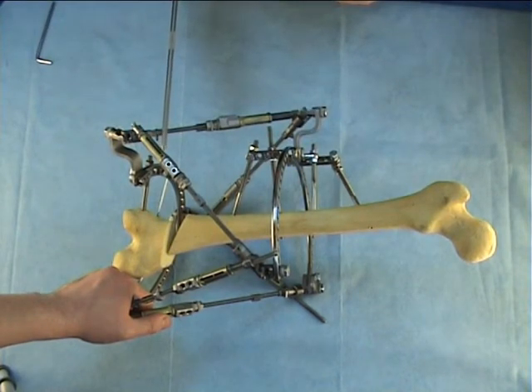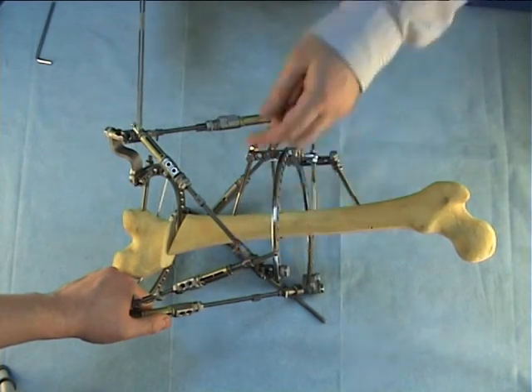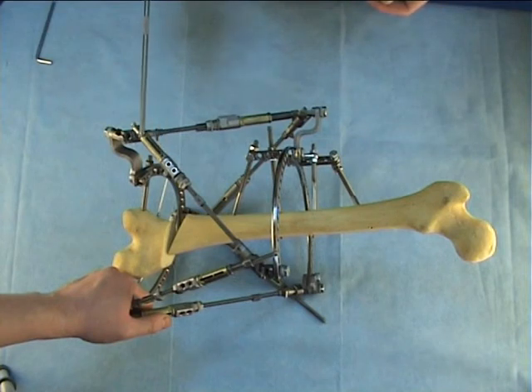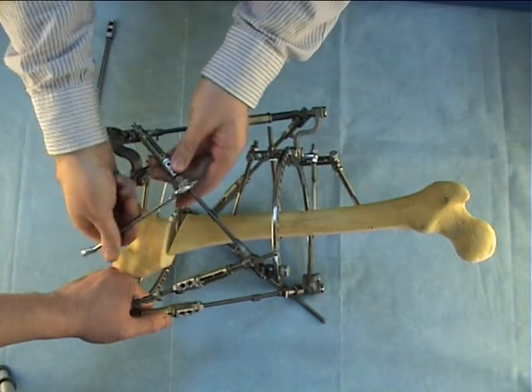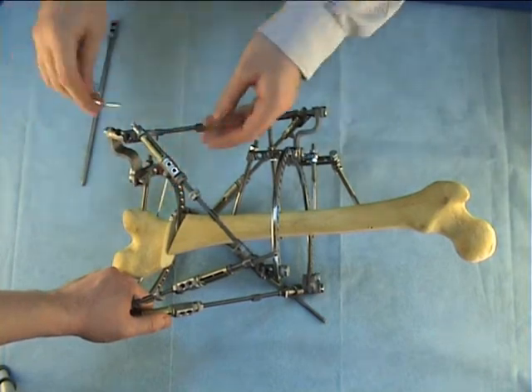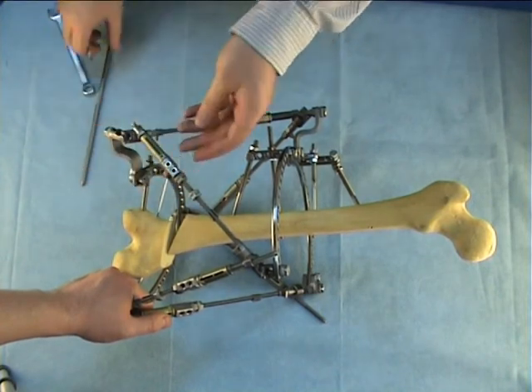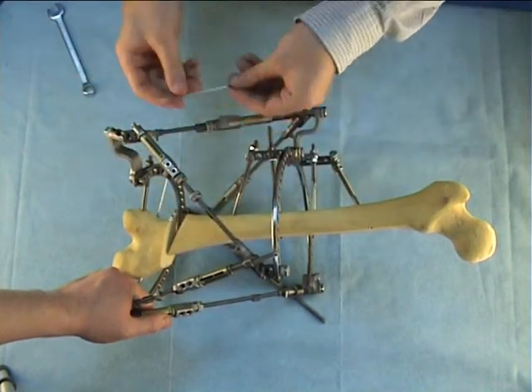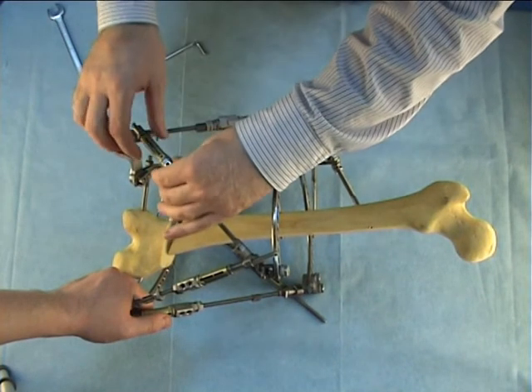Another example. While making gradual deformity correction, the strut came to its minimal value. We have to make a reverse procedure, but this reverse procedure will be in another direction, as in the previous example. First, we take the 12 mm range and untighten the lock nuts. Then we have to use the allen key and untighten the second screw, the screw which is close to the yellow cylinder.